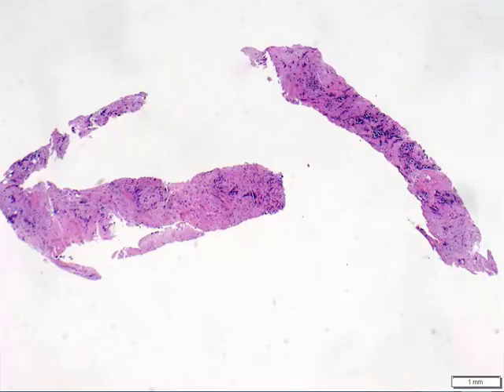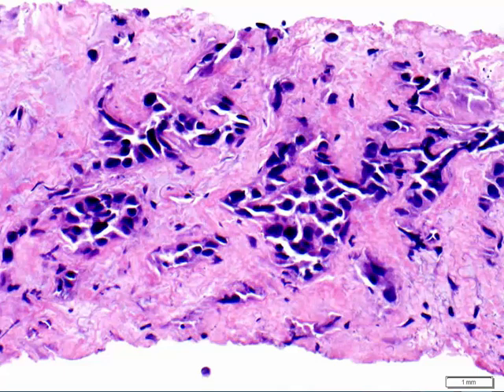Here's an example of a needle core biopsy that shows clusters of tumor cells in a desmoplastic stromal reaction. On high power, these cells are large and do have some cytoplasm, indicating non-small cell carcinoma. However, there is no keratinization or gland formation that could help us to further subtype this tumor.